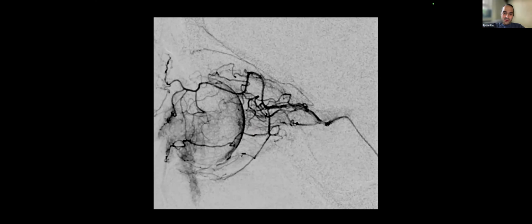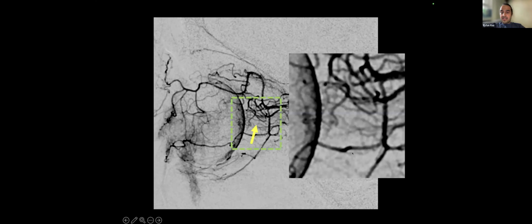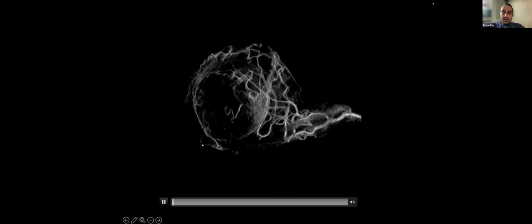By the way, we go inside, and here, at first glance, I didn't recognize it. I decided to do the treatment regardless, even if I didn't analyze anything. But here it is. This is a finding I'm going to show you a little better later on. There is indeed an occlusion of that vessel. And before injecting, I did this magnification image that shows there's something odd there. And I did a Dyna CT with a microcatheter hand injection.